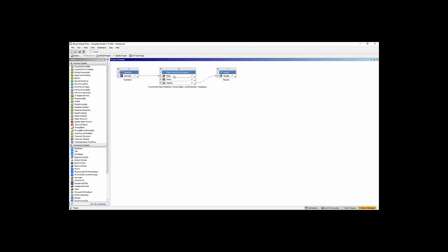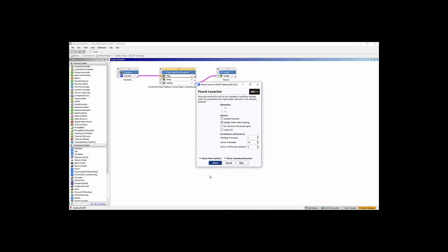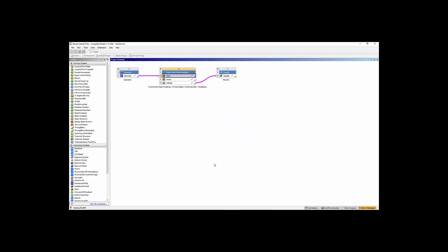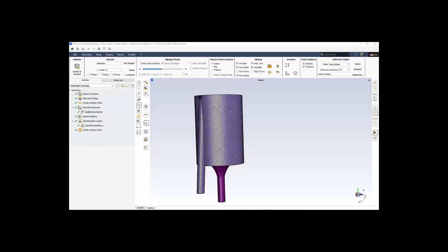So for Fluent meshing, we just double click on the mesh component, which then shows us starting here. We say we're opening the Fluent launcher. We say start, and we open up Fluent meshing. This is Fluent meshing. Of course, this mesh has already been generated.